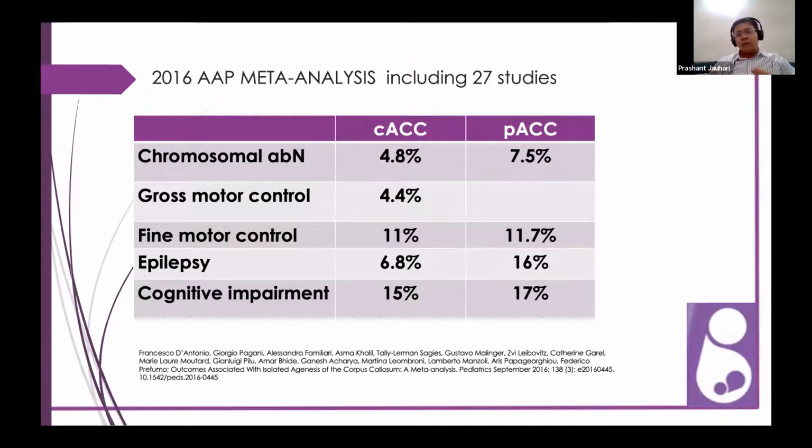clinically in the children with, say, spastic diplegic cerebral palsy who are born preterm, they have this posterior thinning at times of the CC. So this helps us to determine the timing of insult, and then we can see that there is an association. So we consider this as a severe neurodevelopmental abnormality.